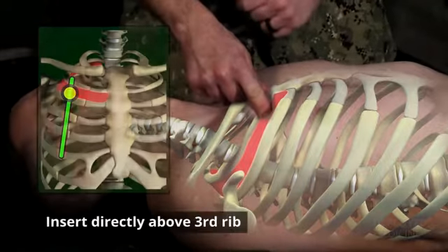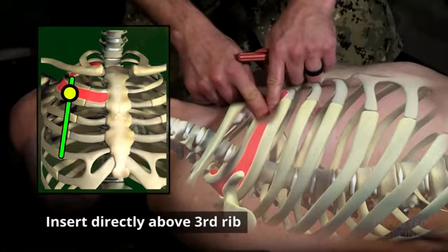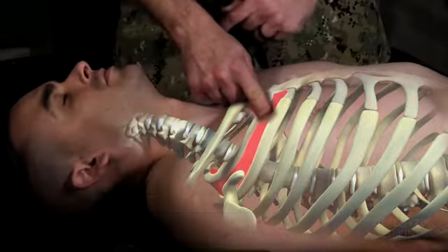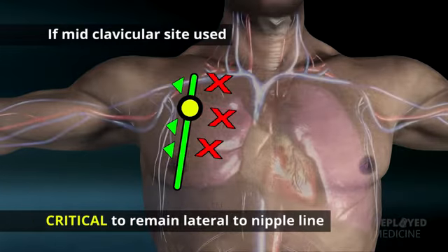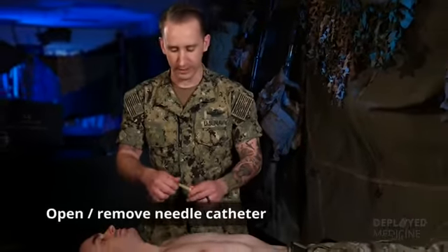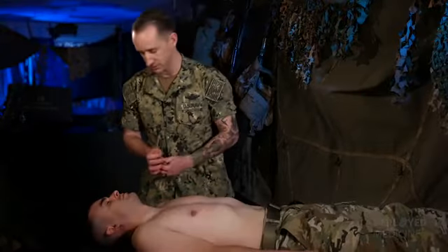I'm going to insert my needle catheter here, directly above the third rib, so that I don't hit any arteries or veins along the bottom of that second rib. If the anterior MCL site is used, it is critical to remain lateral of the nipple line to avoid the heart and large blood vessels. Once I've identified my site, I'm going to remove the needle catheter. Remember, it's 14 or 10 gauge, 3¼ inch.